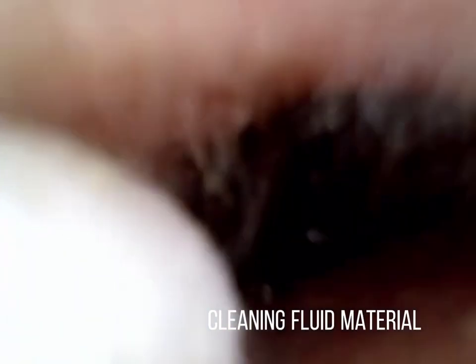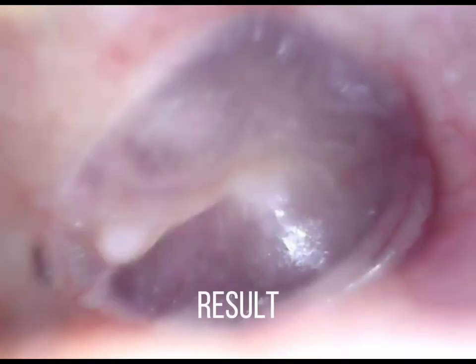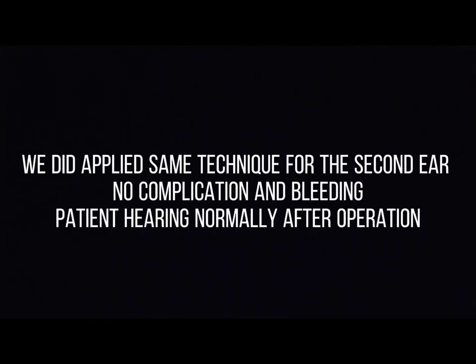And we have a nice and clear ear now. Lastly, we are cleaning the external side of the ear canal and taking the fluid materials. In my opinion, the result is really fine.